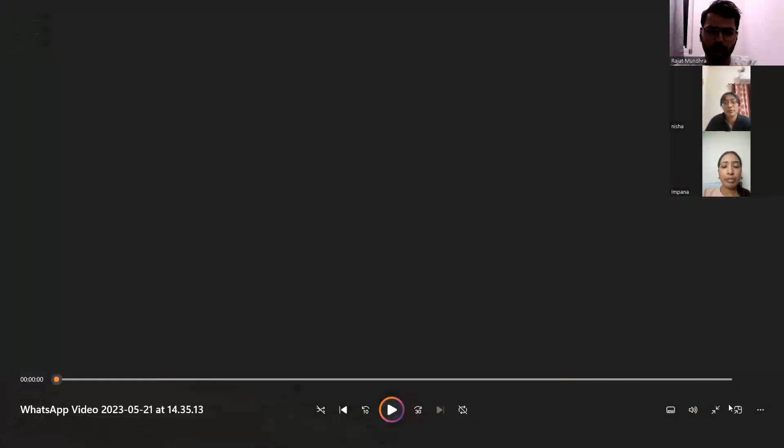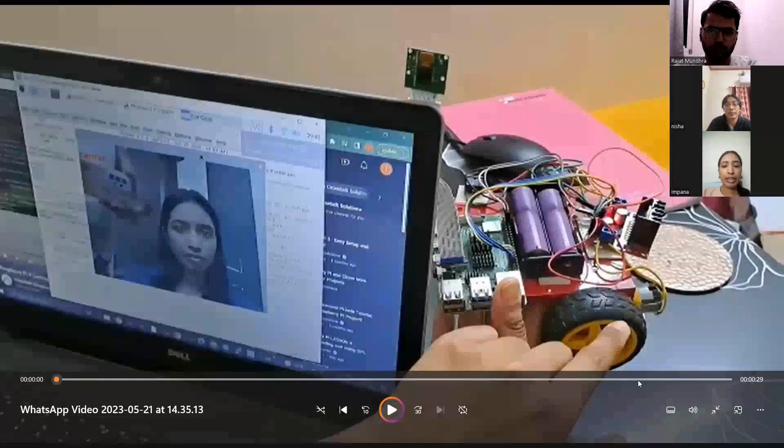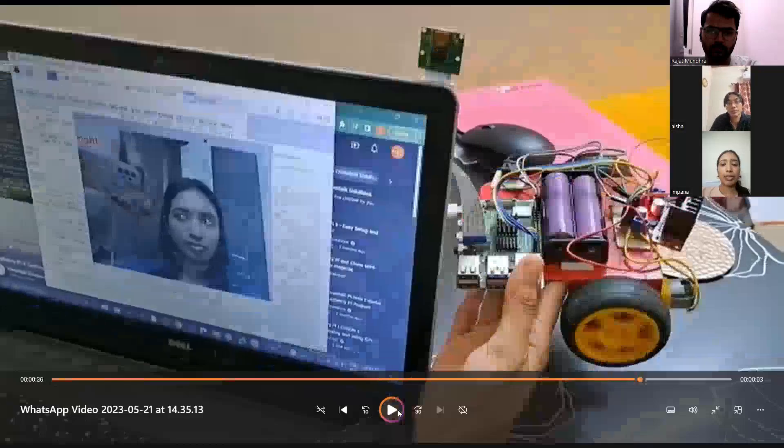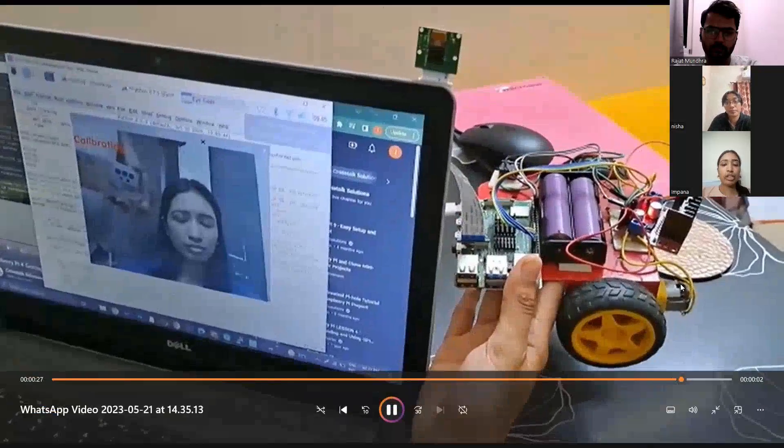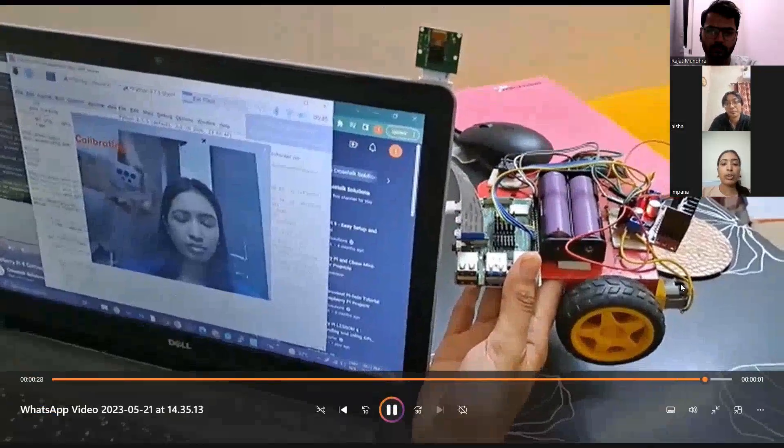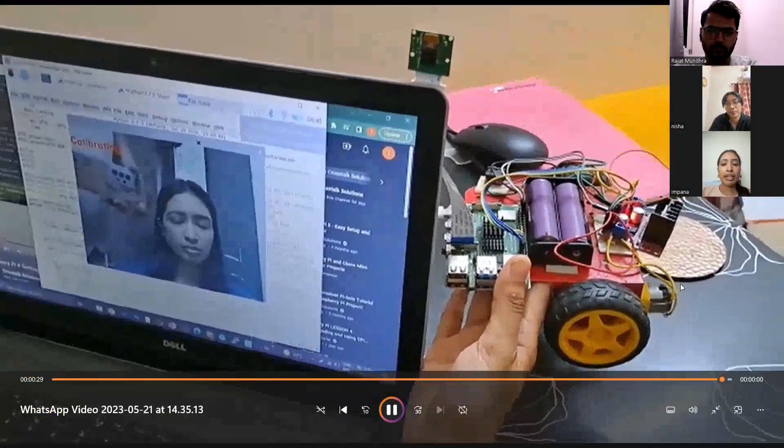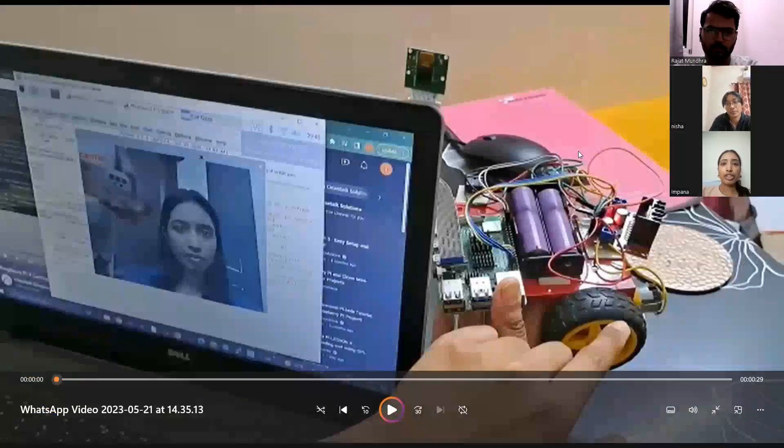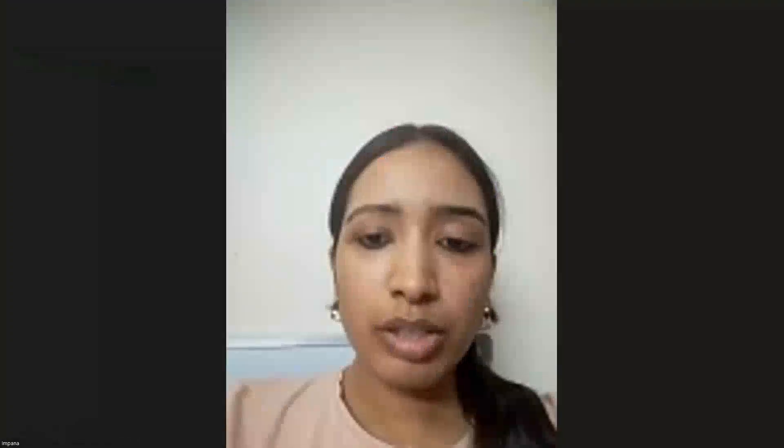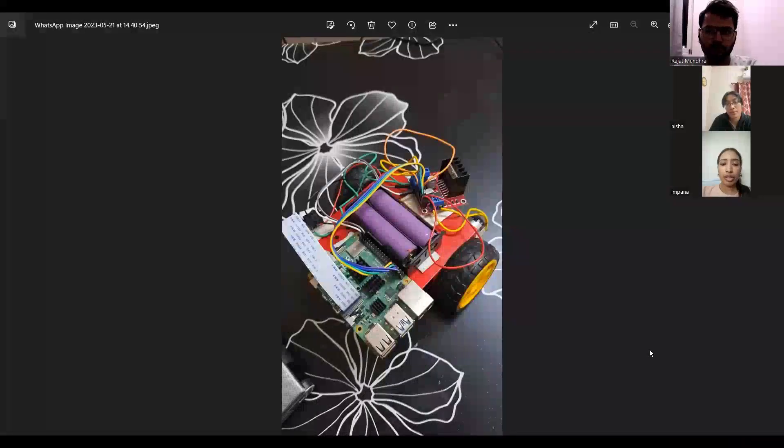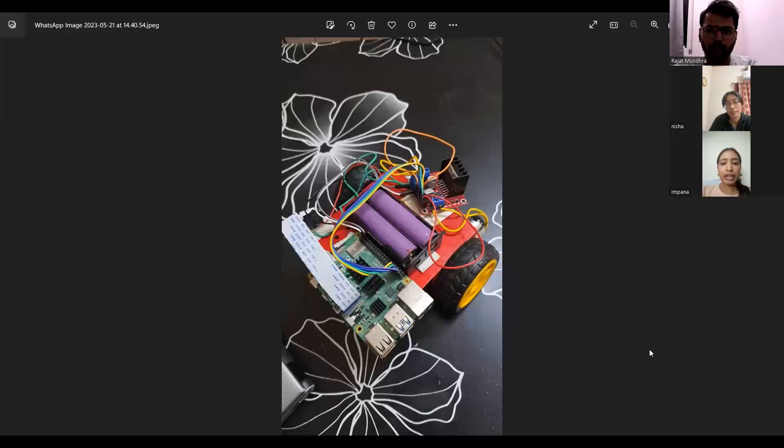And when I blink or close my eyes, the wheelchair movement stops. The blinking is mainly to ensure that an accidental blinking by the user does not stop the wheelchair immediately. But if the eye is closed for long enough, it calibrates and subsequently stops the movement. This is the demonstration of our project.